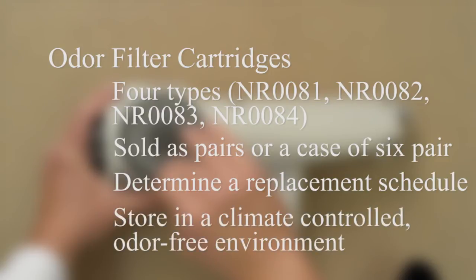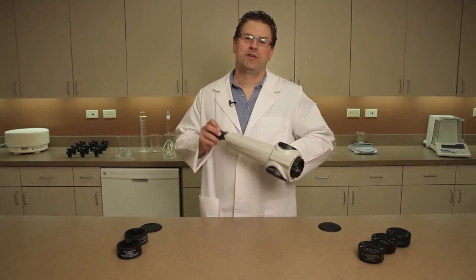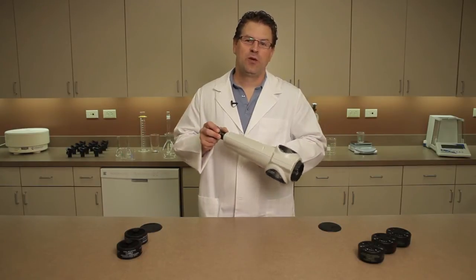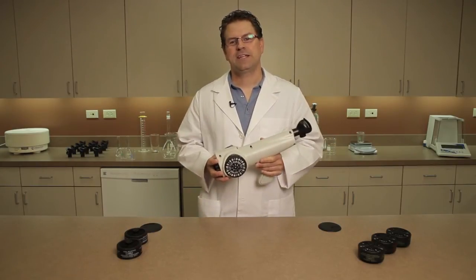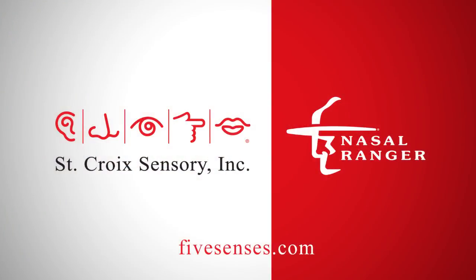The Nasal Ranger and cartridges should be stored in a climate-controlled, odor-free environment. Thanks for taking a moment to learn about the odor filter cartridges for the Nasal Ranger Field Olfactometer. Watch for our other videos on various aspects of Nasal Ranger's use and contact us with any questions. St. Croix Sensory is committed to helping make your project a success.